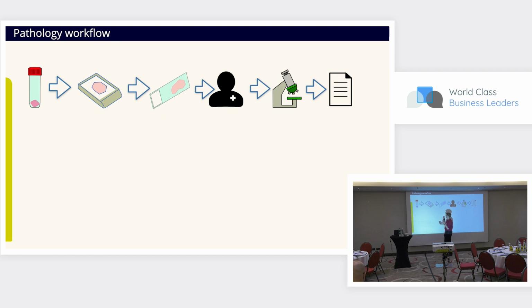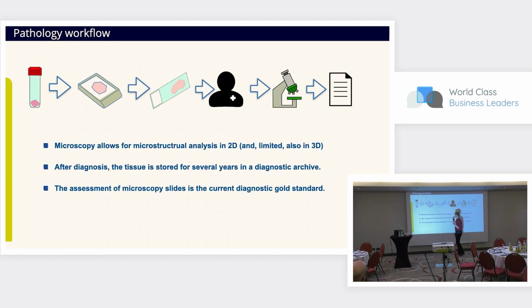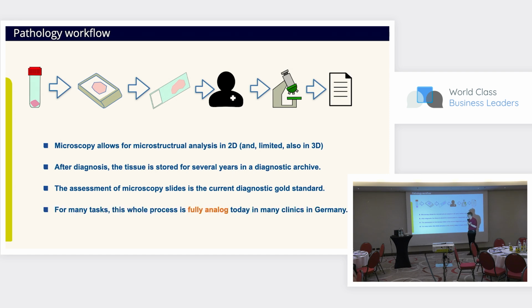Okay, so this workflow is, as of the time of speaking, mostly a completely analog workflow. So there's no digital part involved here, as you can see. And especially in Germany, 95% of diagnosis is still done like this. So really the completely analog way. And I think this might be surprising for those of you who are all into digital business models and so on. There is nothing digital involved here. Maybe this goes into the hospital information system nowadays, but that's about it. So fully analog. So what can we do about that?